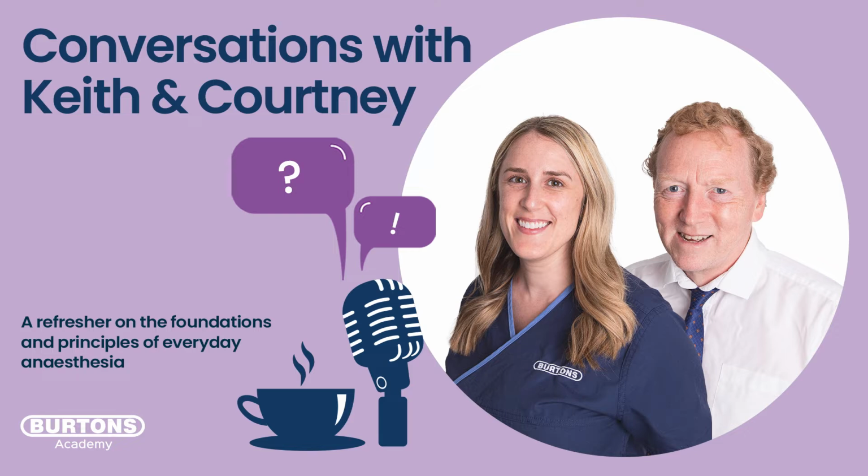So before we get started, I thought just for our listeners, we might clarify some terms around capnography. So we've got normocapnia. This is when we have a CO2 of 35 to 45 millimetres of mercury. Anything below 35 millimetres of mercury is called hypocapnia, and anything over 45 millimetres of mercury is called hypercapnia. So I thought just to set the scene, to clarify those terms.